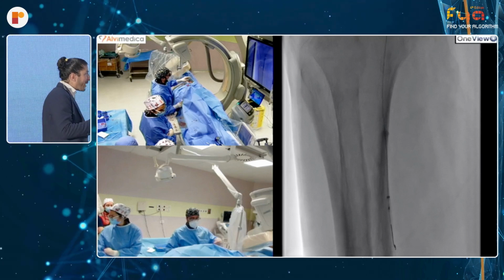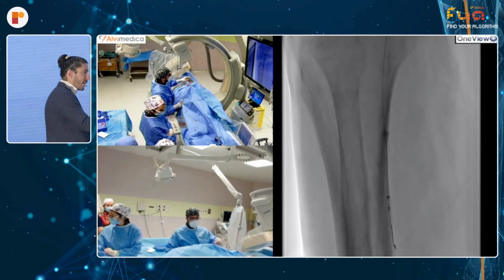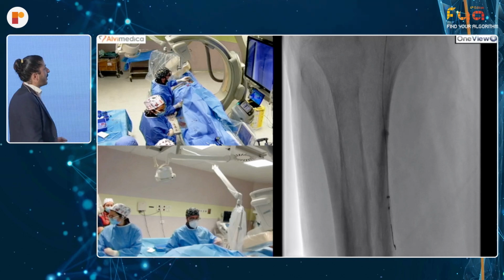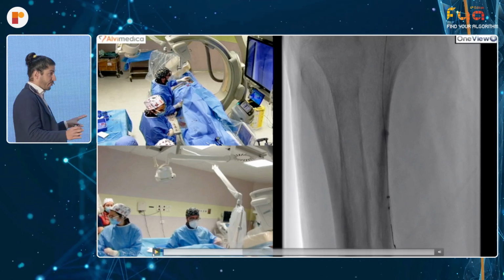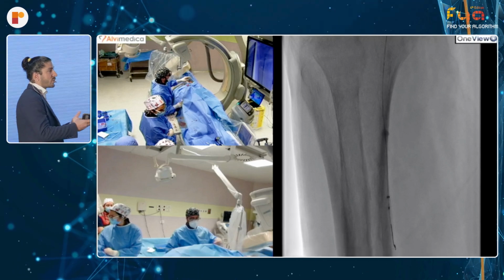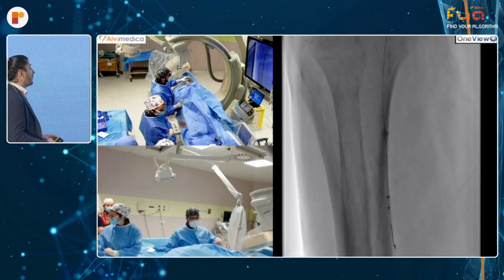So it was quite clear from my perspective, seeing two tarsal branches, one lateral, one medial, and I suspected the absence of dorsalis pedis. But as I said, until this point, I was not sure about the anatomy, but decided to approach the posterior tibial, even because there was some landing, a very distal landing zone at the forefoot.